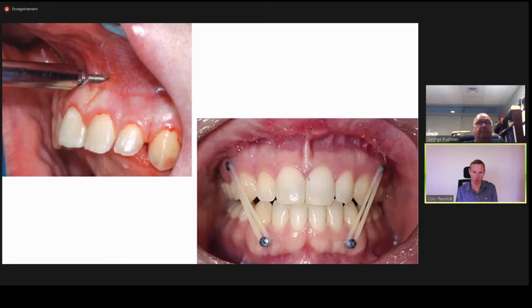They can be used for guiding elastics postoperatively, although that can be difficult, particularly for patients to change these elastics over. It's a very long distance typically to go from one IMF screw to another, and it can be a little difficult to stretch the elastic that far and get it to be anchored on those screws. So patients sometimes have a harder time with that if they're changing the elastics themselves than if you have something like an Erich arch bar where the lugs are much closer together. But they certainly can be used for postoperative guiding elastic therapy in the right scenario.